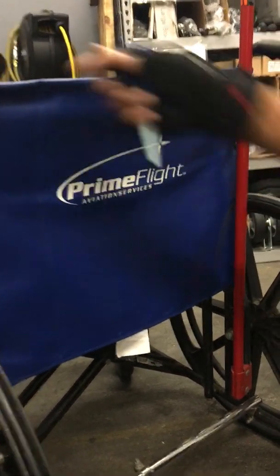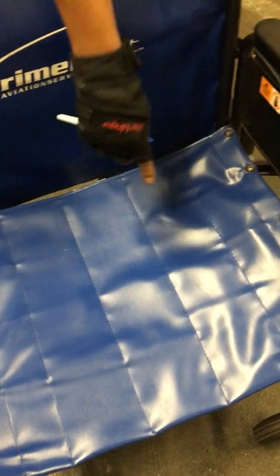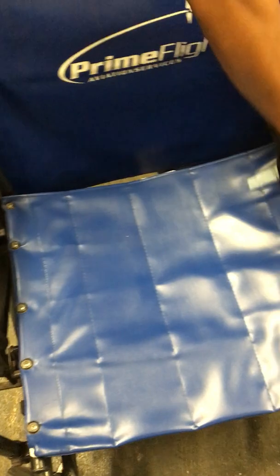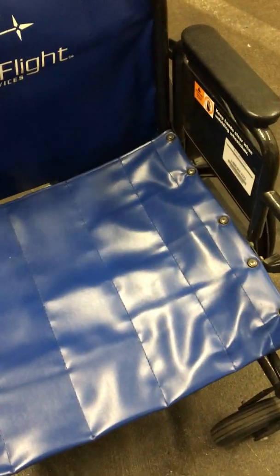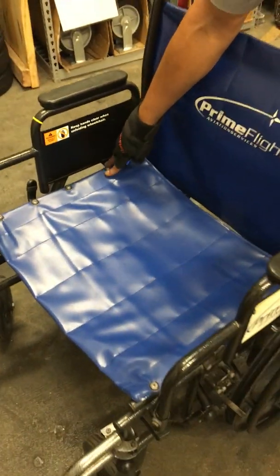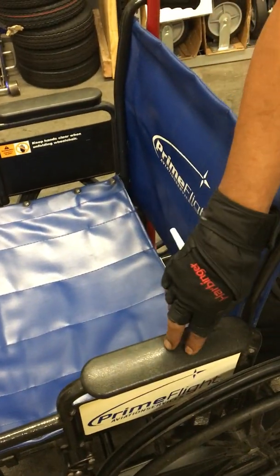Next would be the seat cushion. Same thing, the inspections, hoping all the holes will all be aligned with the cushion and the framing. It would take about 30 minutes. However, if it doesn't, it would be between 30 to 45 minutes again. Next would be the armrests. Armrests do crack easily sometimes. And to change both of these would be 15 to 20 minutes.